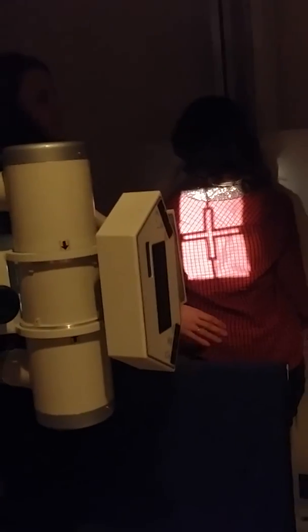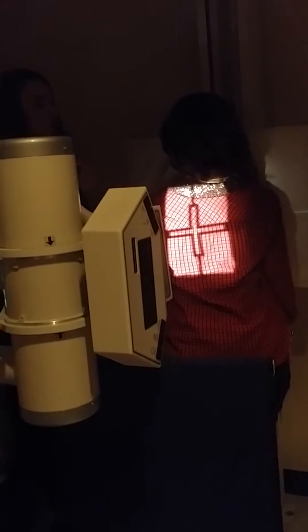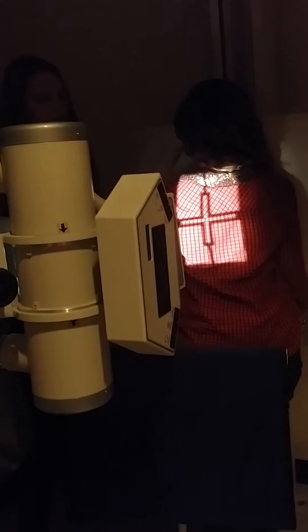I'm just palpating for her jugular notch — I want to make sure I have a little bit of light above that. If you're not sure where to center up and down, it's also at T7, so you can feel for the inferior border of her scapula, which is exactly where you're centering.